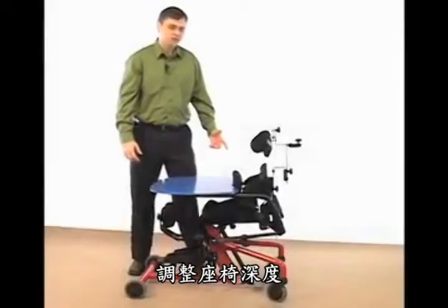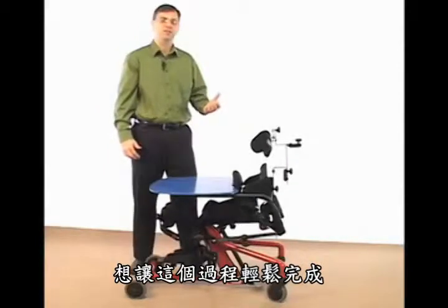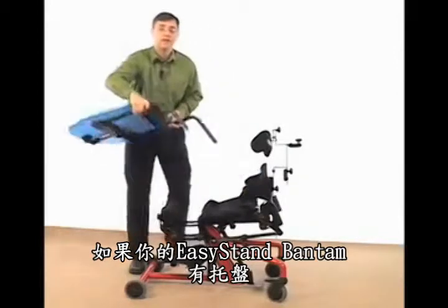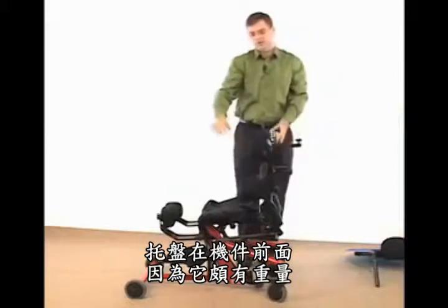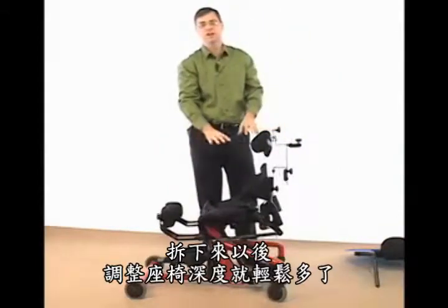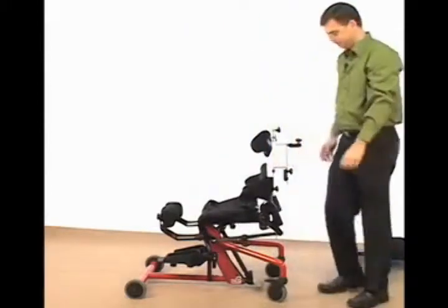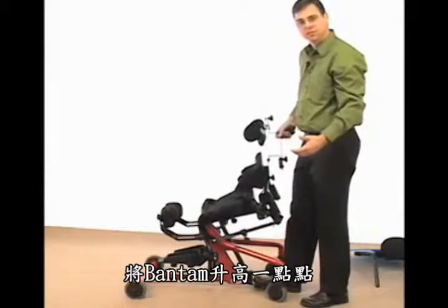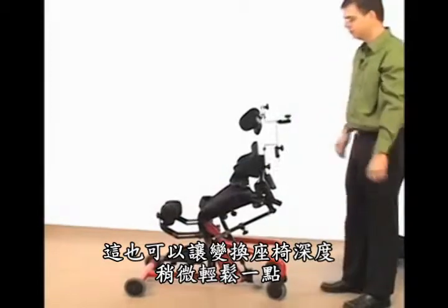Let's take a closer look at adjusting seat depth. When adjusting seat depth, we want to do this before the child gets into the unit, and to make this process as easy as possible, it's always a good idea to remove the shadow tray if you have it on your Easy Stand Bantam. The shadow tray adds weight to the front of the unit, so by taking it off, it makes your seat depth adjustment much easier. Second, elevate your Bantam just a little bit — this will also facilitate and make your seat depth transition easier to do.